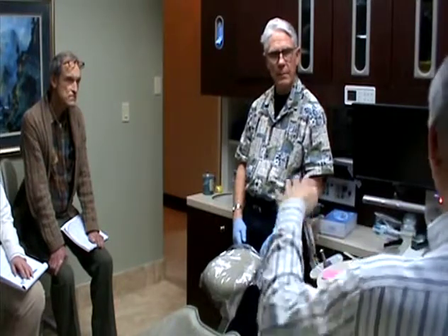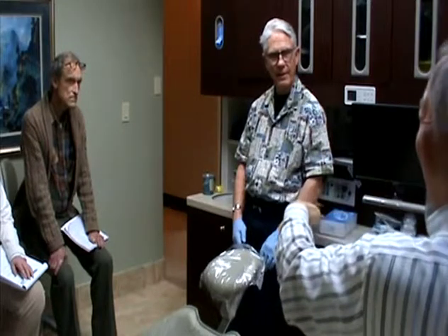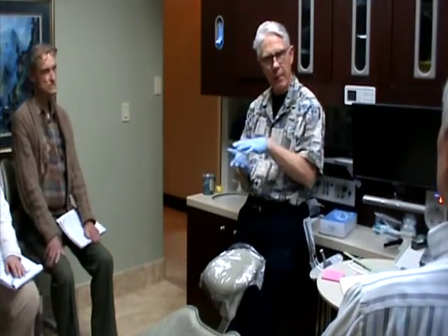Okay, because it's easy in Joseph's case, it's 4 millimeters on each side, it's very different with 6 and 16. But when you put the paper in and close your teeth on it, that paper bends a little bit in there. When you put the Aculiner, it's flat, it's not giving you the same height really.